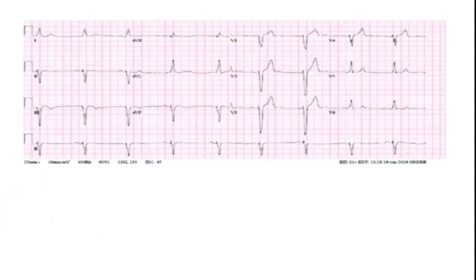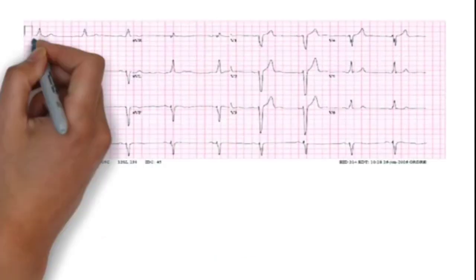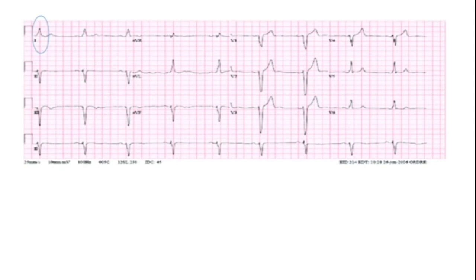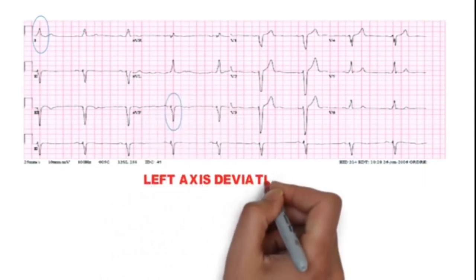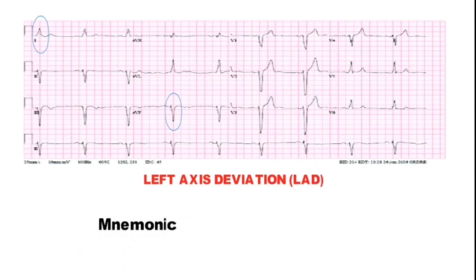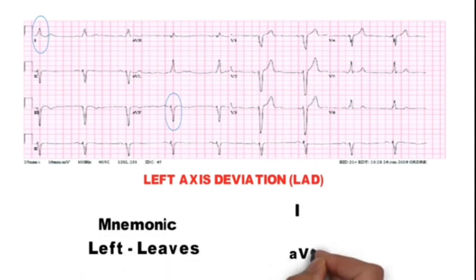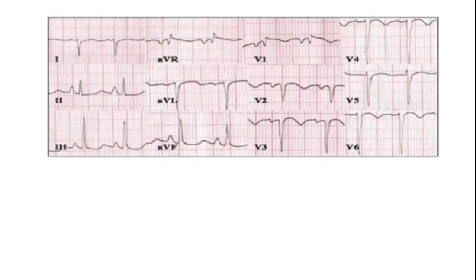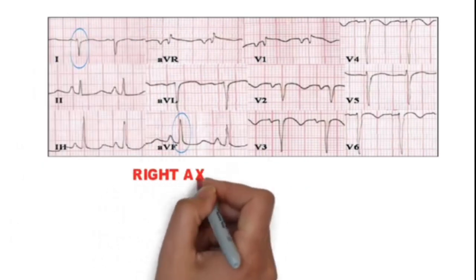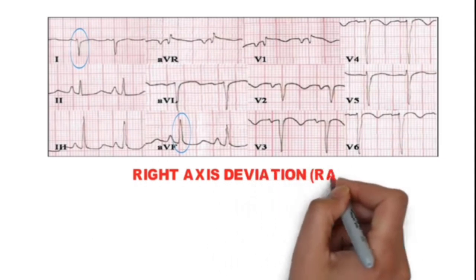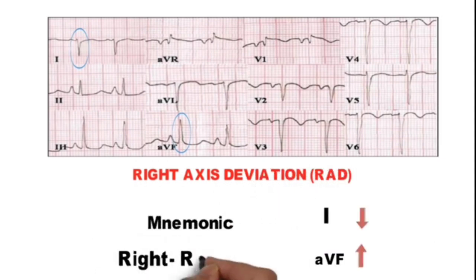Now look at this ECG - net QRS is positive in lead 1 and negative in AVF, showing left axis deviation. You can remember it by mnemonic 'left leaves'. Whereas in this ECG, net QRS is negative in lead 1 and positive in AVF - this is right axis deviation, remembered by mnemonic 'right returns'.